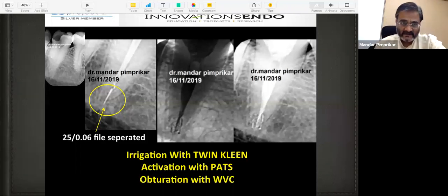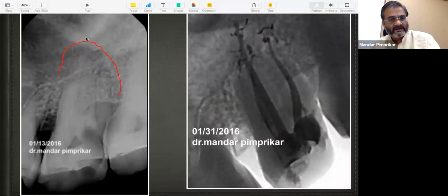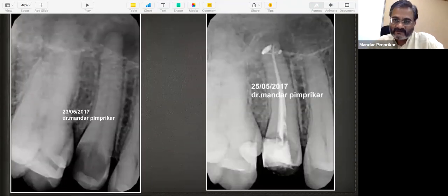That is the message. Here also, whenever you see the periradicular radiolucency, you expect multiple portals of exit, and they are there. So if you want to have predictable outcomes, you need to clean these root canal spaces, and with informed knowledge of the irrigants and irrigant activations.